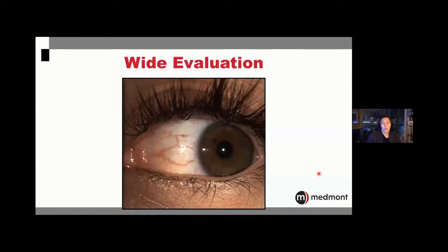Then for understanding other areas of the ocular anatomy, as for instance, looking at the conjunctival redness, looking at the fitting of the edge of our scleral lenses as an example, we have a tool that does really beautiful imaging, as well as lid margin, lid disease, any kind of issues that we see on lashes or beyond. So man, we've got this tool that does this beautiful high resolution photography and illuminates it in really an optimal way.